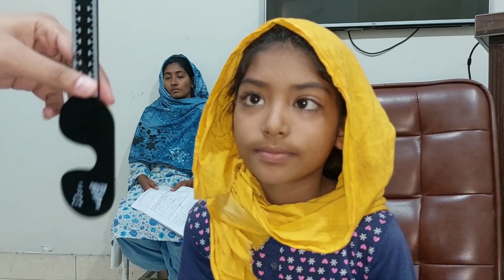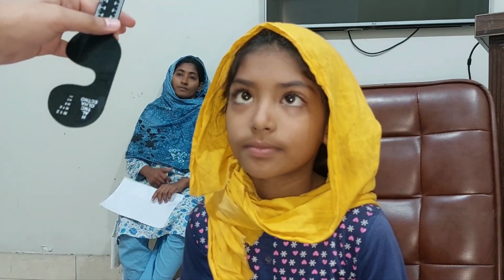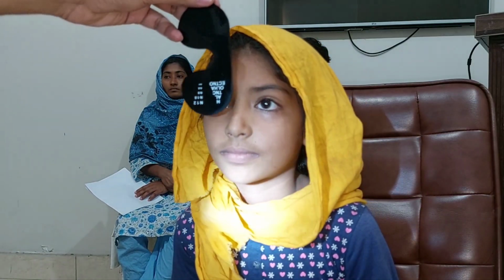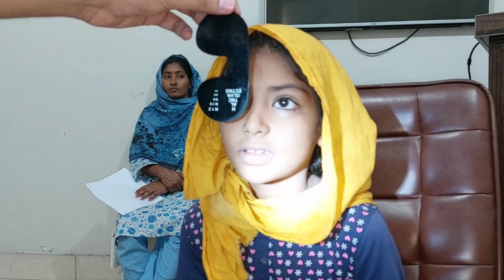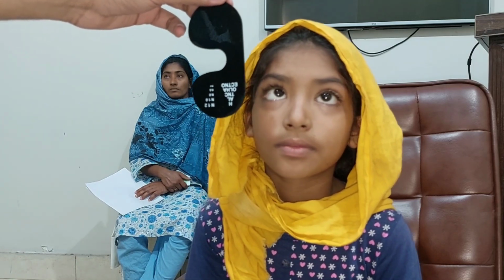Okay. So you have done the cover uncover test. Now you will do the alternate cover test. Again ask the patient to fixate either on a far object or you give a near target.